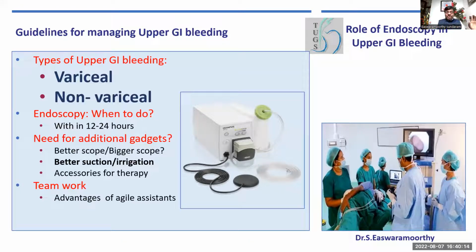I have a hemostasis tray. It'll have everything, like a varices tray, and we'll have plan A, plan B. We have a team concept. Before I start, I'll tell them, I'm going to use this endoscopy. If I see this lesion, I'll do this. If not, this is what I need. They should not go after the accessories. You need to keep everything ready before you venture out.